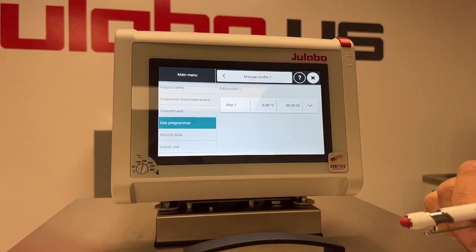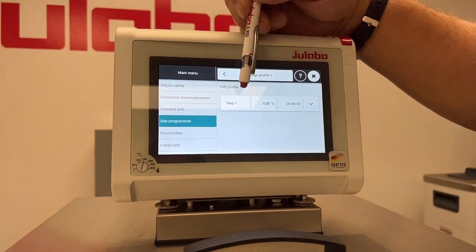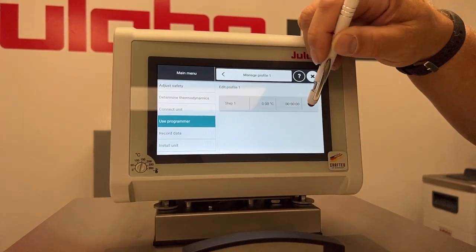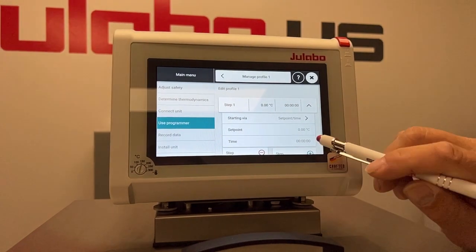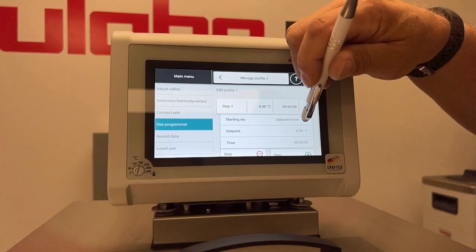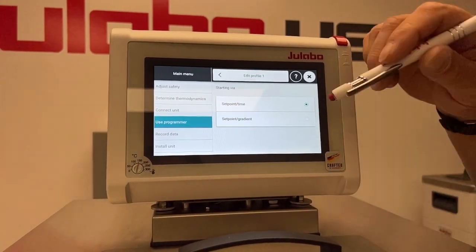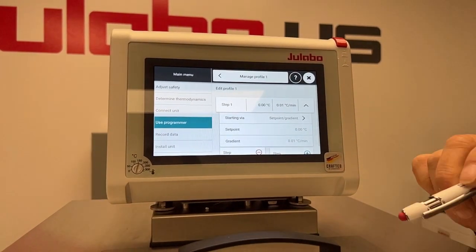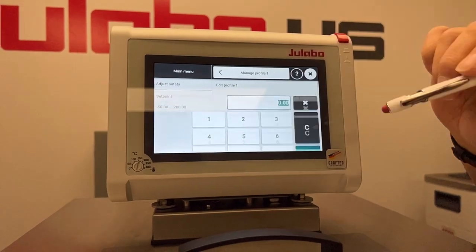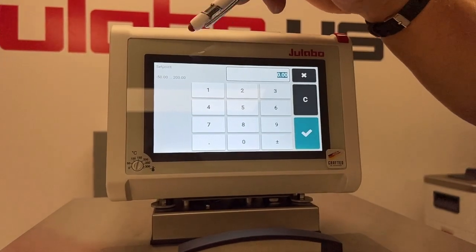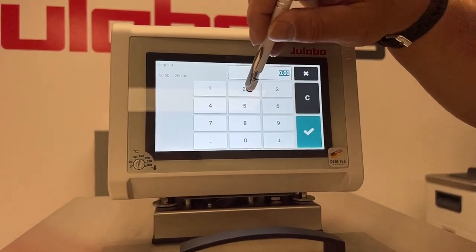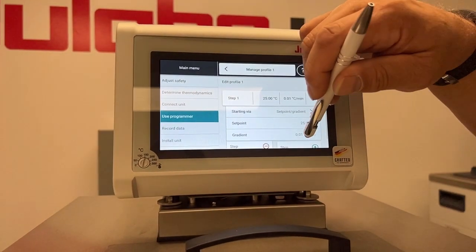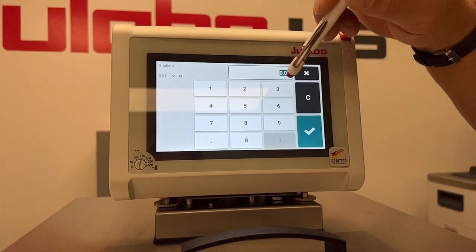We'll go into Edit. It starts off at Step 1, which has a time and a temperature at zeros. We can change the setpoint from time to a gradient. Then you just select your setpoint — let's say 25 — and then set your gradient.